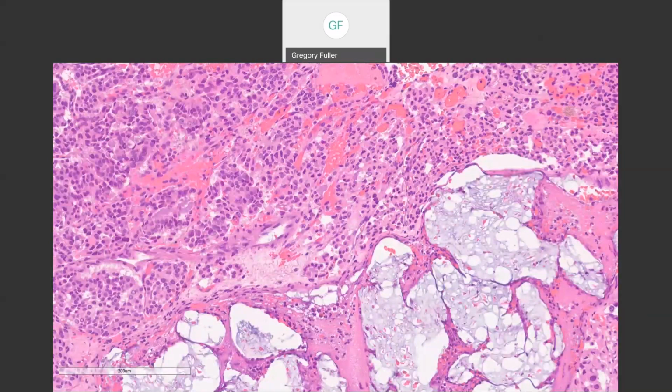I'm going to pause just for a few seconds here to let anyone chime in with the chat. Now this is spine. We're talking about spine lesions, all right? And you're looking at this spine lesion, and I want someone to take a stab at it, using all of the information. All right, I've got adenocarcinoma. Yeah, that does look glandular. That does look like adenocarcinoma. Can you please be more specific and tell me why?